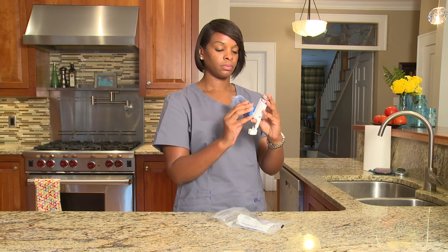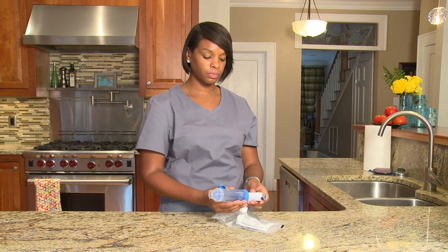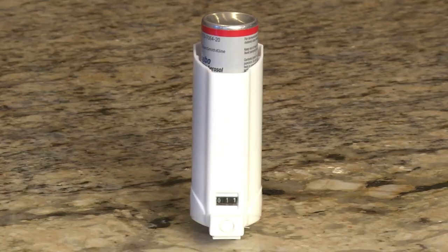If your doctor orders more than one puff per treatment, you will need to repeat steps 1 through 8. You should wait about one minute after your first puff before you breathe in your second puff. Check your MDI counter after every time you use it to help make sure you have enough medicine for the next treatment.